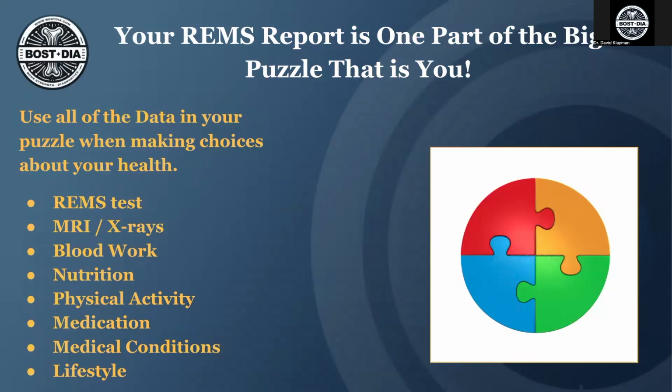And I also remind all of my patients that I work with that your REMS report, while it is vital information for the quality and the structure, the strength of your bones, and it's a very important piece of the puzzle, it's one of many pieces of the puzzle that makes up you and your health. When you're looking at the data and you're trying to figure out what should I do about my health and well-being, I remind you to utilize your REMS report, but also look at if you have prior x-rays or MRIs, if there is blood work, if you have any nutritional information as to the quality of the nutrition in your body.